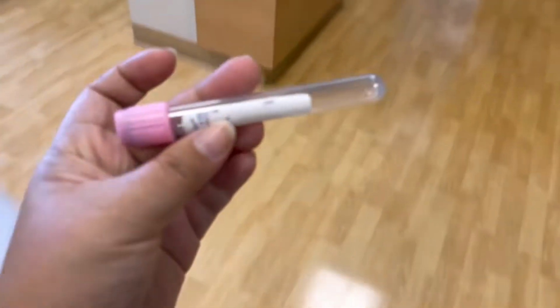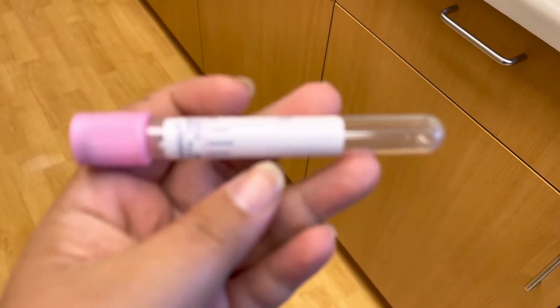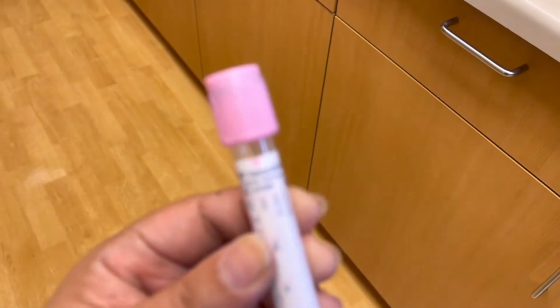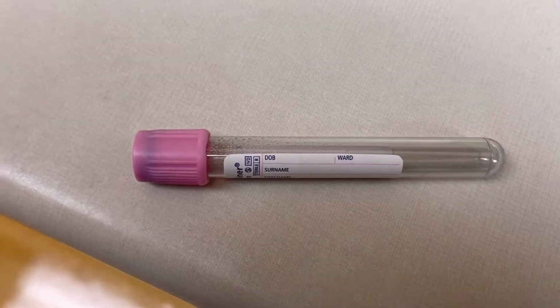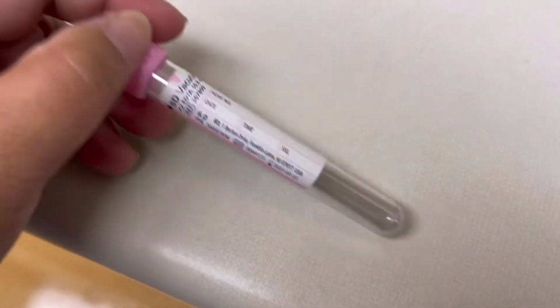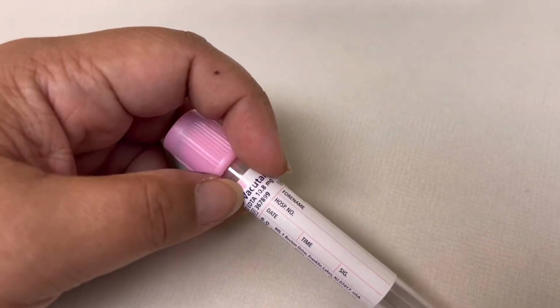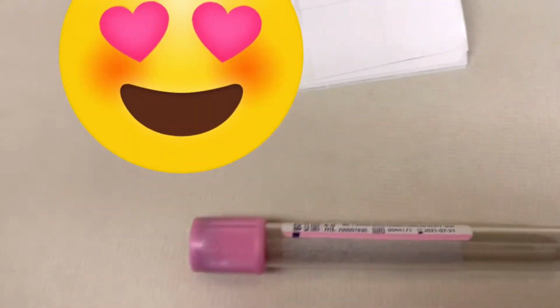Okay, so when you are drawing for blood typing or the blood bank, it goes on a pink top tube like this. The thing with this is that it has the same additive as the lavender tubes over there. It has EDTA. It has 10.8 milligrams of EDTA, I believe.